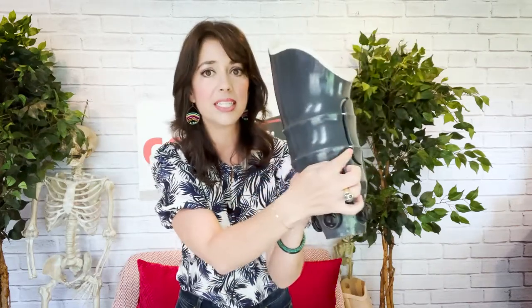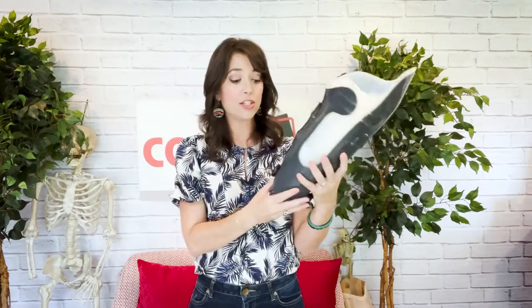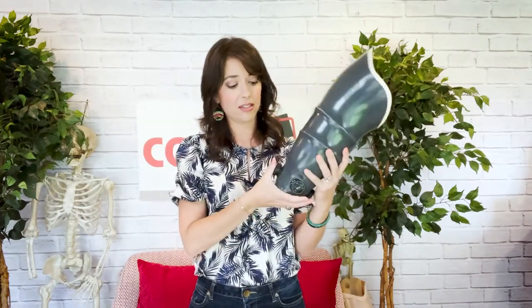Here you can see an example of the gap design, and here is a sample of the panel design right here. You can find a picture of the hinge design in the links below. Now once your limb is in the socket, you twist the click reel or boa dial — depending on which one you have — to tighten or loosen your socket as needed throughout your day.